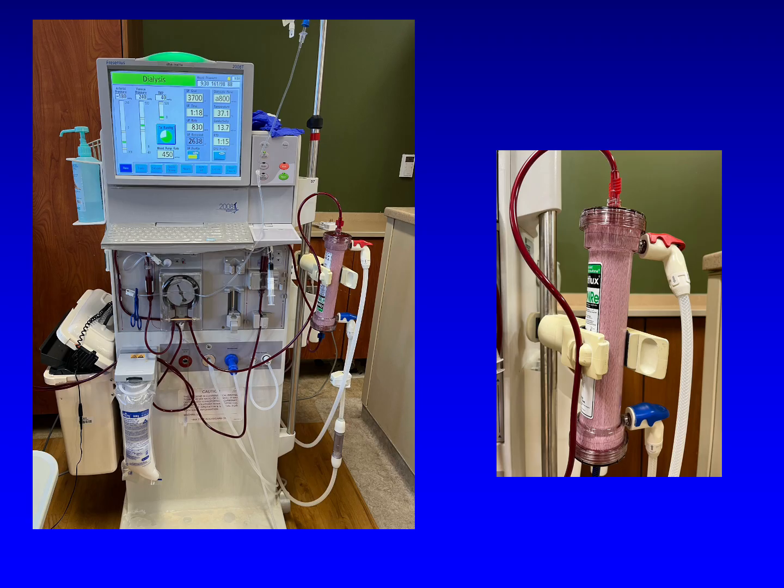So here is an actual dialysis machine, and you can see the patient's blood flowing through the dialysis cartridge in this direction from the red end to the blue end. Its flow rate is controlled by a roller pump, with the cartridge being here on the actual machine. The dialysate flows in the opposite direction and is continuously discarded down the drain after a single pass.